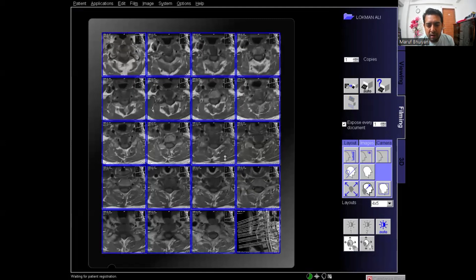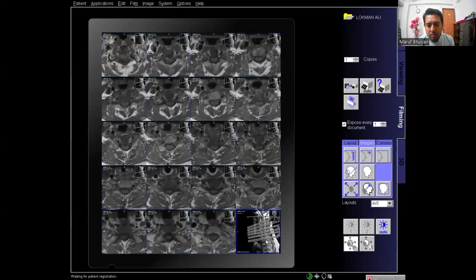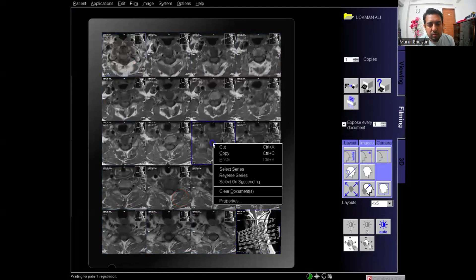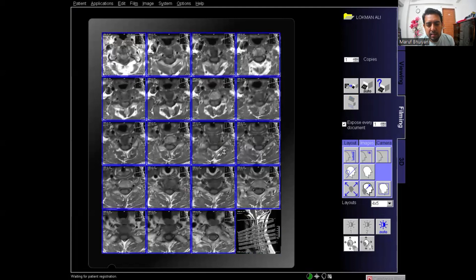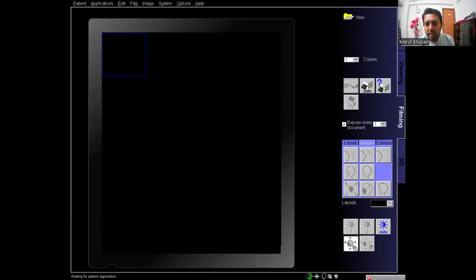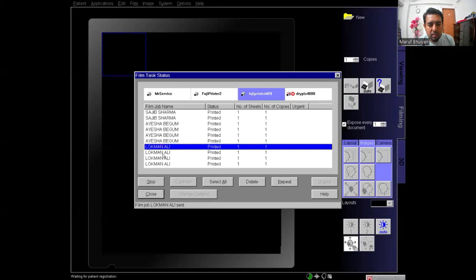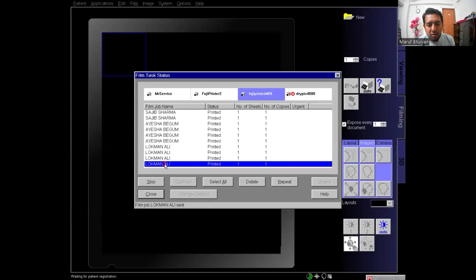I am adjusting the zoom of the images. After adjusting I recheck the film, then check the printer. From the printer I can confirm that for patient Lokman Ali, 4 films have been printed.